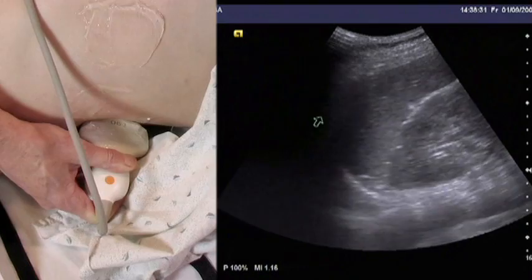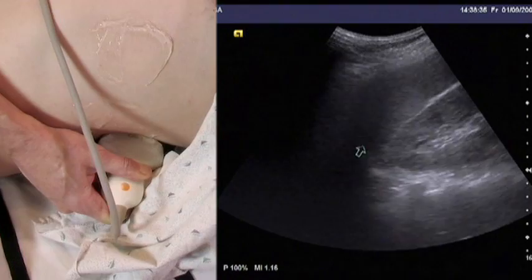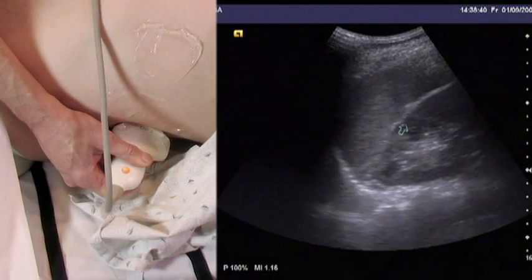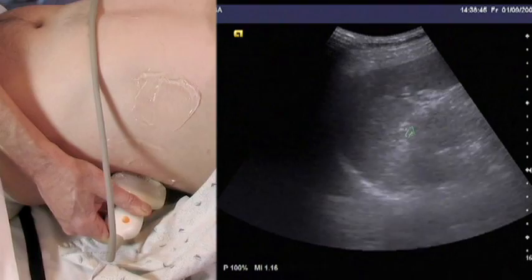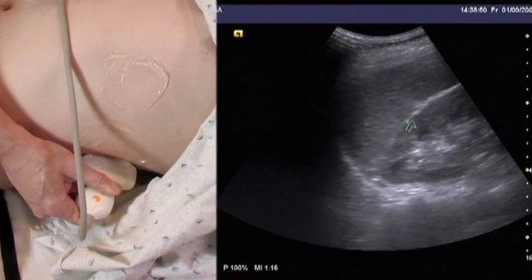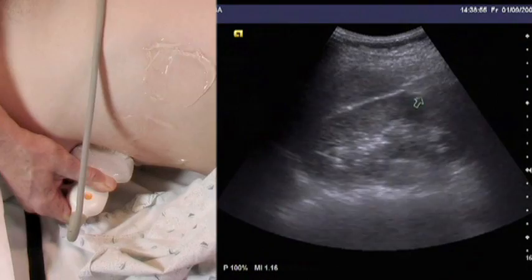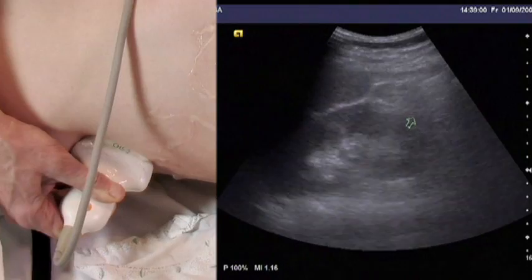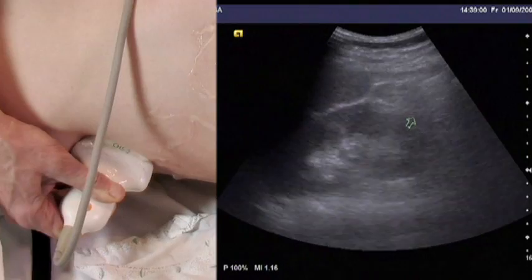The four spaces being checked in the left upper quadrant are: the pleural space, the subphrenic or subdiaphragmatic space on the inferior side of the diaphragm, the splenorenal space — the analog of Morrison's pouch — and the inferior pole of the kidney. Staying off the ribs while scanning through all tissue planes, moving to the next rib space to check the inferior pole of the kidney. This view is more superficial and zooming in helps use all available visual real estate on the screen. No fluid is seen along these structures.